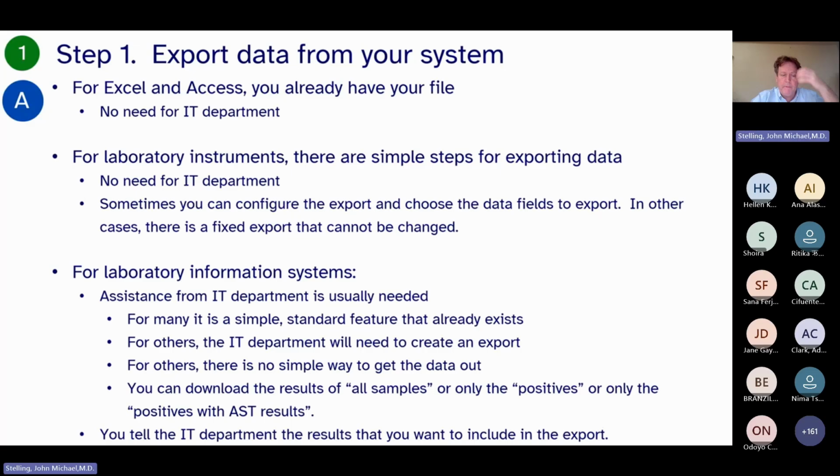On the other hand, with Vitek, there are different versions of the Vitek software. There's Vitek Mila, Vitek 2, Vitek Observa, Vitek Maestria. I'm going to talk about the Vitek 2 software. The Vitek 2 software, you cannot configure the export. You press the button and the data come out. You put a start date, end date, the data come out. The nice thing is that it's easy. You don't have to do anything to prepare it. The unfortunate part is you can't configure it. For example, the Vitek export does not export age and gender. It's in the Vitek, but it's just not part of their standard export.